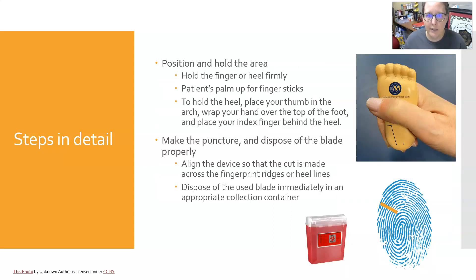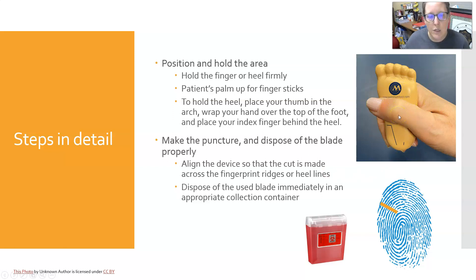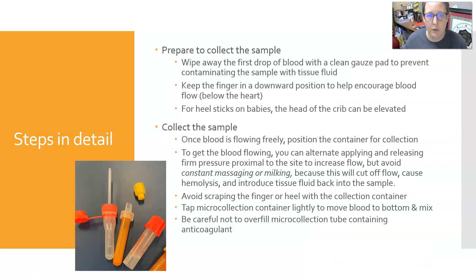Position and hold the area firmly — for finger sticks, place the patient's palm up and hold the finger; for heel sticks, place your thumb in the arch, wrap your hand over the top of the foot, and place your index finger behind the heel, as demonstrated on the model foot here. Then make the puncture, aligning the device so the cut is made across the fingerprint ridges or heel lines, and immediately dispose of the used blade in a sharps container.